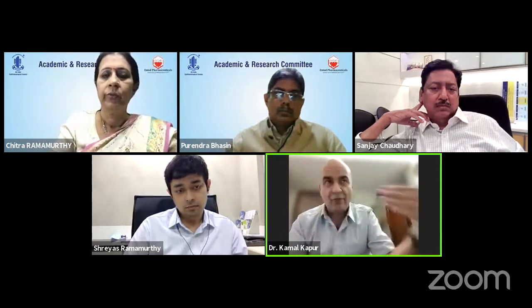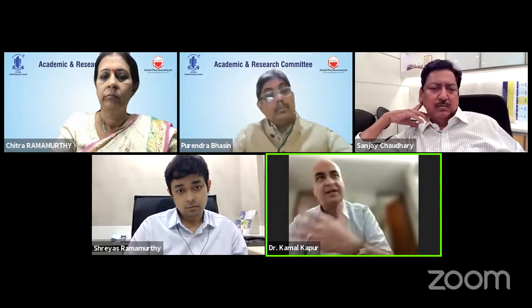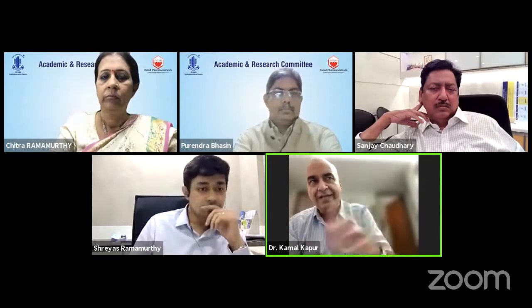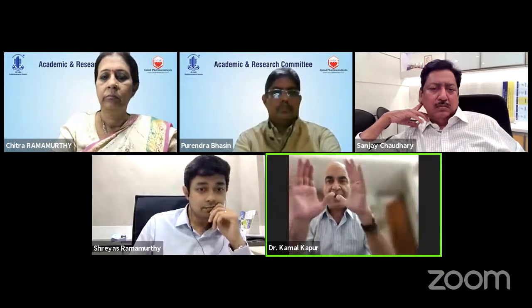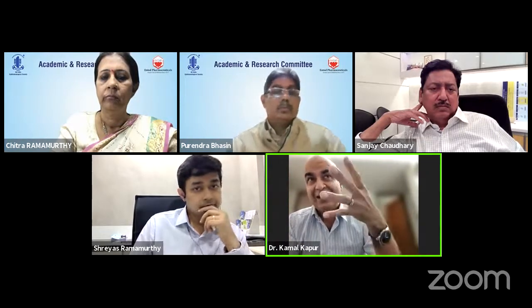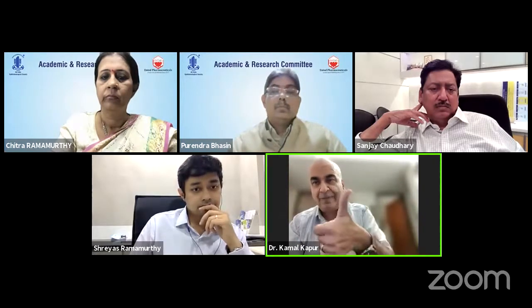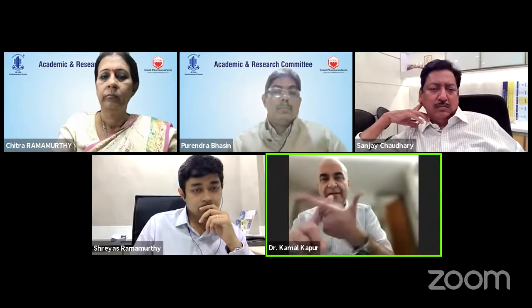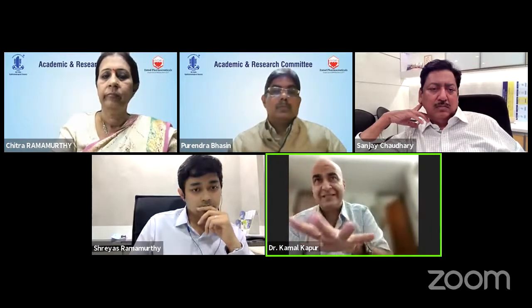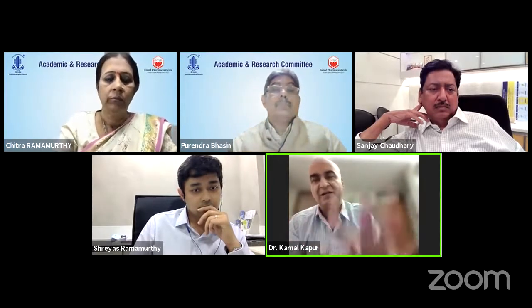Now, if in case it's a high vault, I agree with Dr. Sanjay. I have patients who are 1200, 1300, 1400. I'm following them up. They are great. So what I look for is a plateau of iris coming up. Number two, if the pupil is accidentally dilated on Tropicacyl Plus and the iris is getting stuck, not getting back to place, I would explant. I do a gonioscopy, and again, I look for pigments. If these things are there, I would explant, but if they're all fine, I would not explant even at 1300.